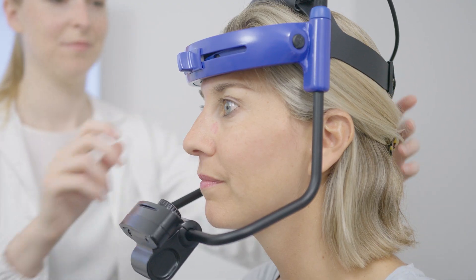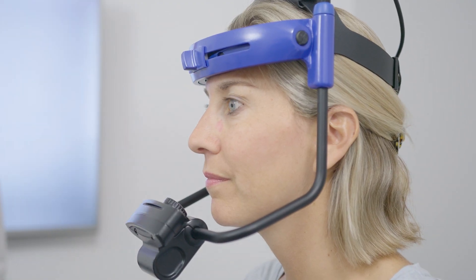When opening the Synapsys VNG Module the first thing to do is to calibrate the camera. For the procedure you can refer to the video on installation and configuration.